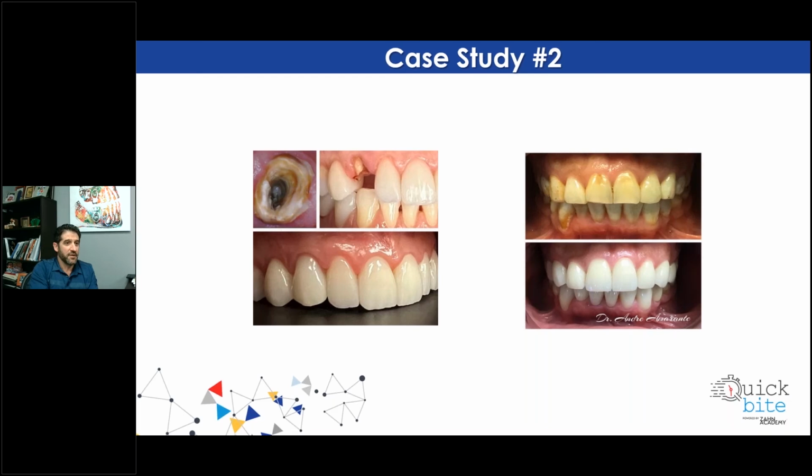So saying all that, when a customer calls and says, I want an Emax on that, we will call and say, this is not going to work. But we have a good solution for you that's going to blend in really nice. So if you're not going to look into that patient's mouth and look for what's different, this will blend in, you'll never see it.